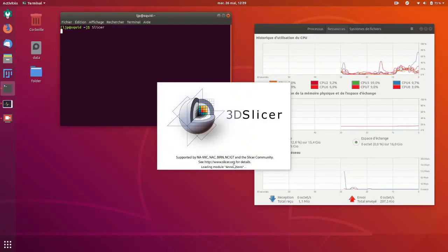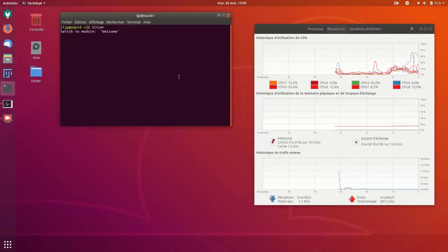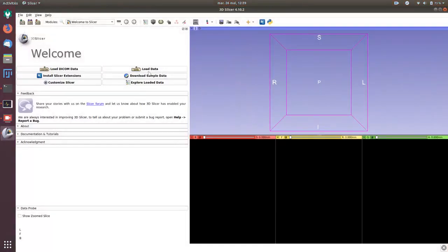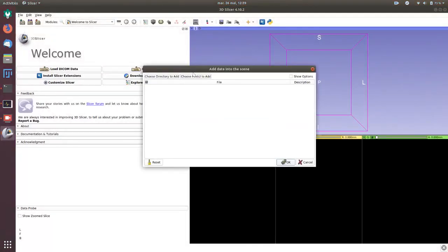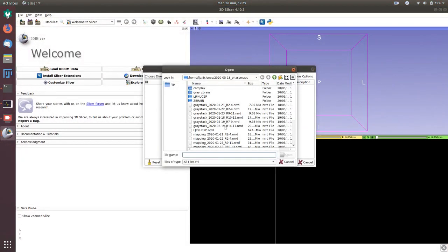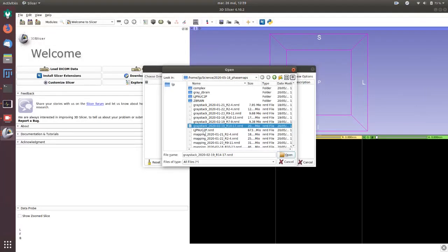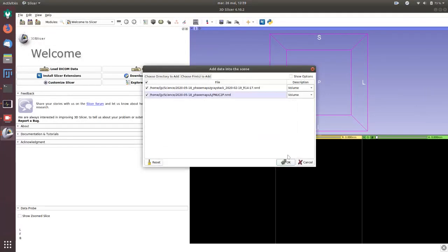So the first thing to do is to load some data and choose, for example, a gray stack that I want to map on the LJPNUC2P reference brain.